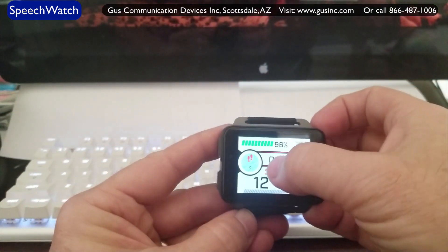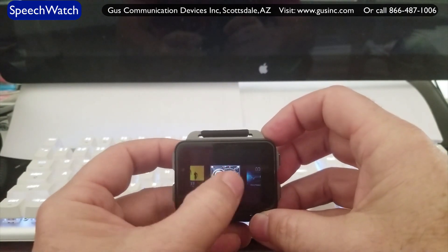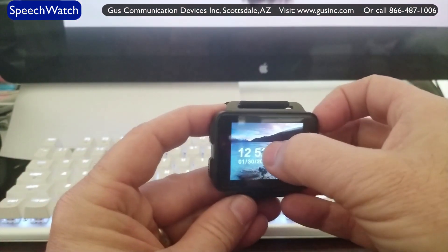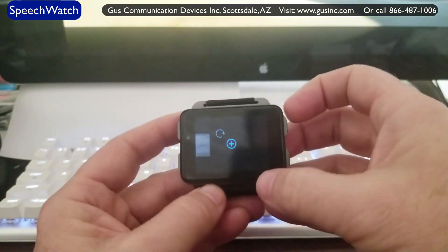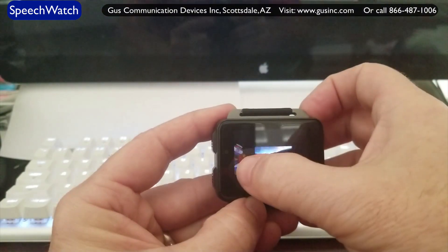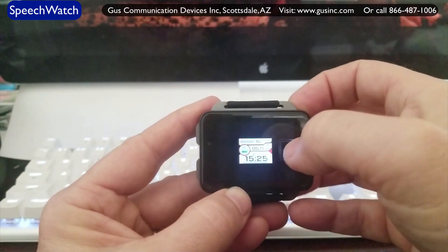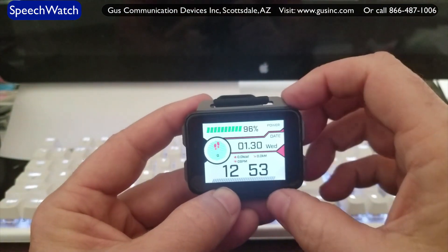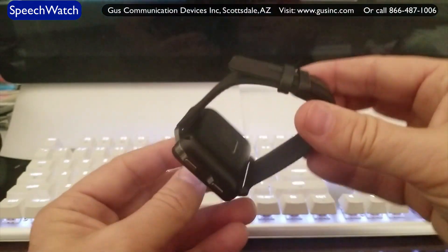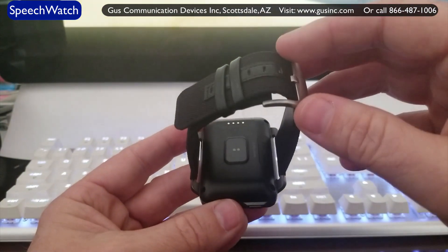If I don't like this watch face, I just press and hold it and I can choose whatever watch face I want. Those are your choices of screens — all kinds of neat screens. Personally, I really like this one because it shows your battery at the top — we're at 96% — along with the date and time really big, and my step counter as well. On the back here is your heart rate monitor. It also counts your steps. This is a fully functioning fitness-type watch as well.